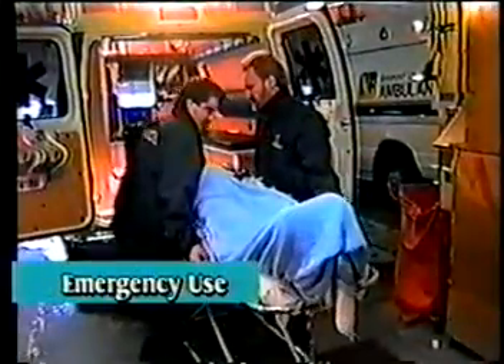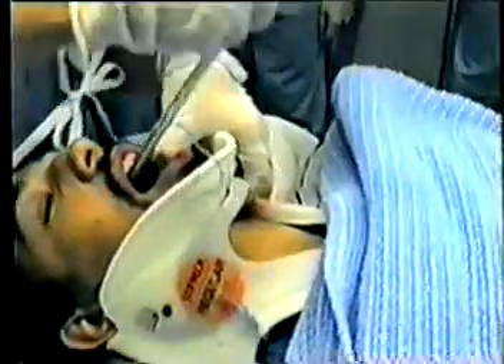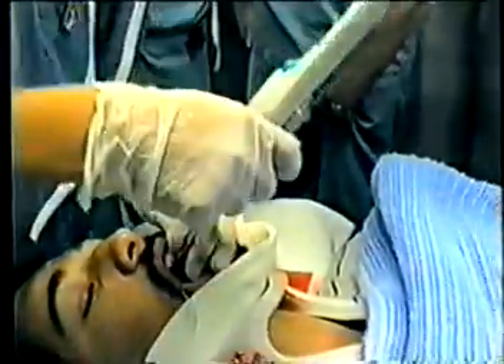The intubation of an emergency patient represents a particular challenge. The potential for aspiration may require the establishment of a patent airway as quickly as possible, yet positioning the patient may be contraindicated, making laryngoscopic intubation difficult, if not impossible. Again, light-guided intubation using the TrachLite can offer an effective alternative.